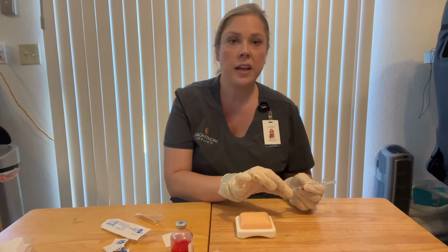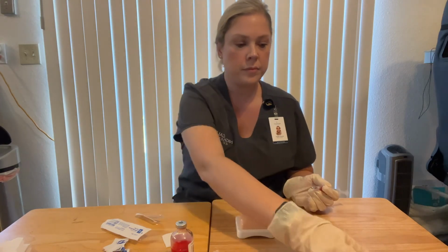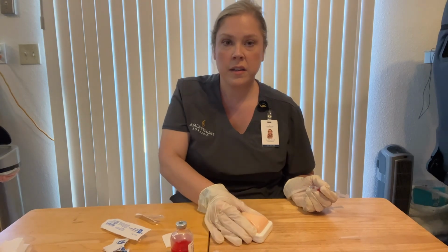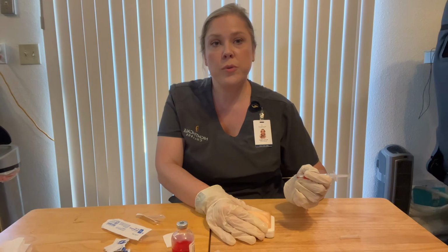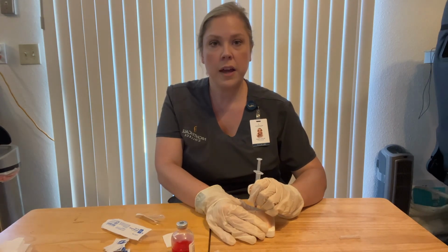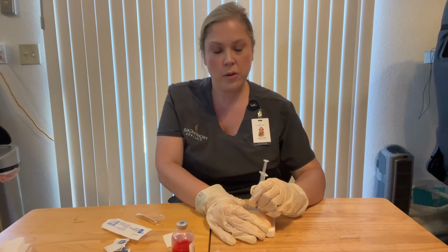I'd want to safely uncap the needle. And then I'm going to want to pinch the skin to get that fold. And then with the sub-Q injection, we want to administer at a 45 to 90 degree angle. Okay. Since it's a heparin injection, we would remain holding that pinch of the skin.